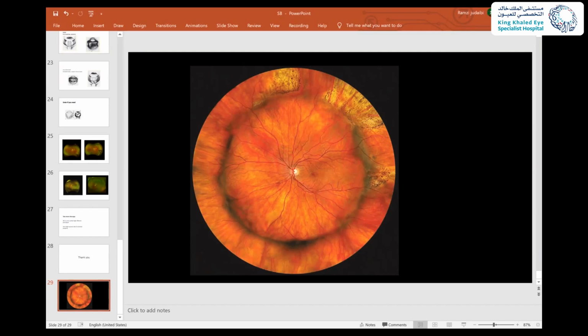Yeah. And what's your take on using the microscope versus doing it with loupes, or just without a microscope, just with the spotlights on the field? Do you have a preference? With the microscope is much better and less stressful on the back, on the neck, and faster even. You can do it in a faster way. Yes, a disadvantage is if you open the vitreous cavity, I understand, but at the end, it's really very comfortable for the surgeon.